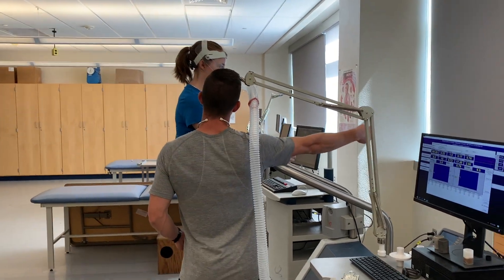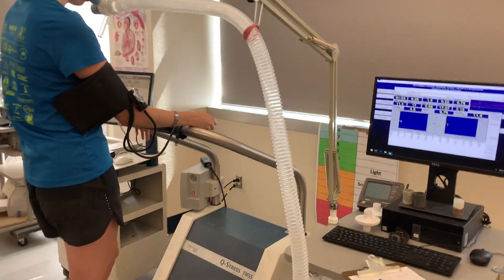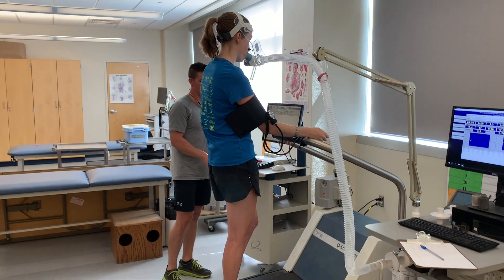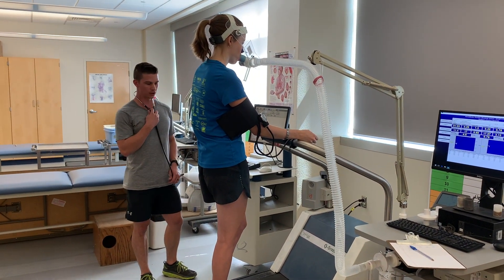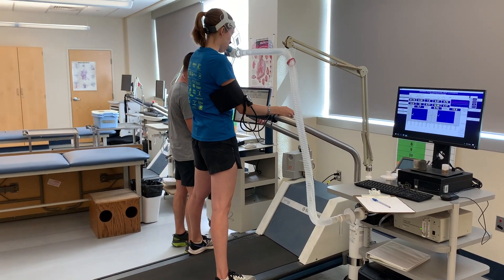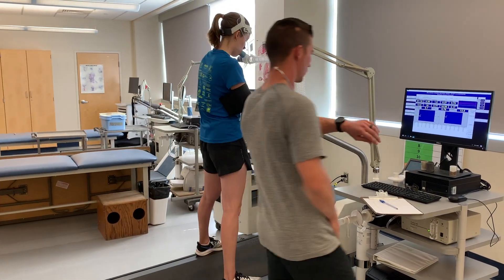Where are you at on the RPE scale? Six. Okay. So since we have the metabolic cart started, I'm going to start the treadmill. We're at 10% grade right now. The first stage of the BRUCE protocol is 1.7 miles per hour. Go ahead and straddle the belt for me while I start the belt. Okay, we're at 1.7, so go ahead and step on whenever you're ready.